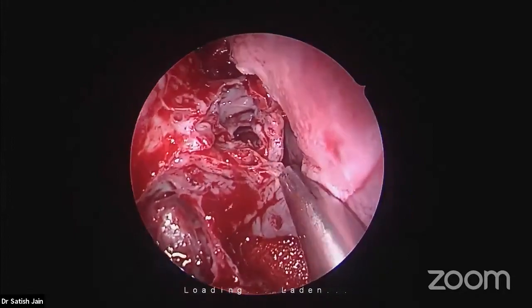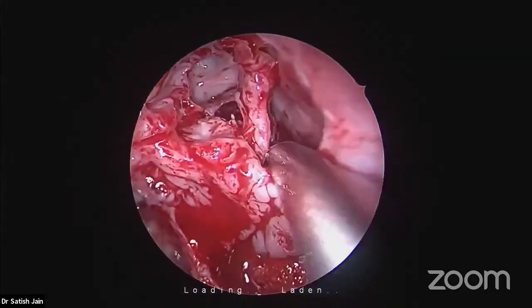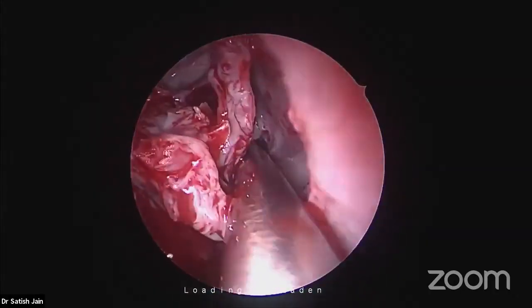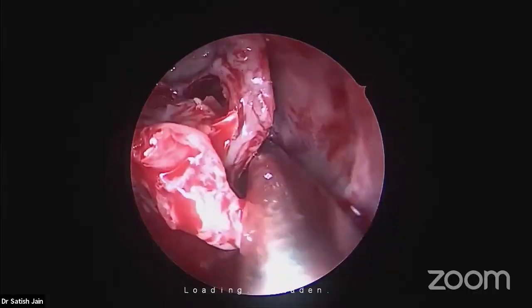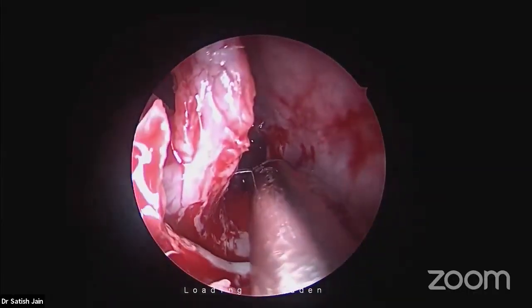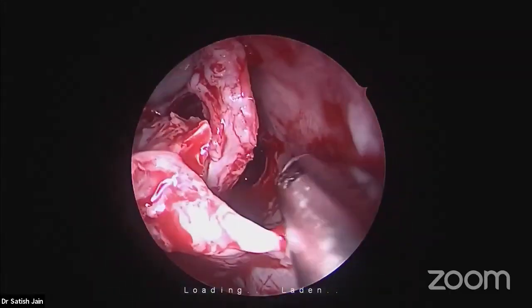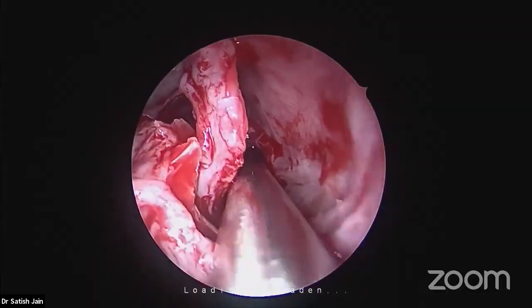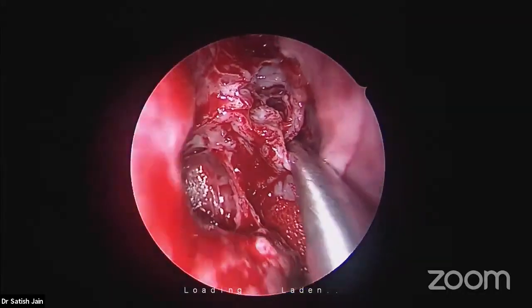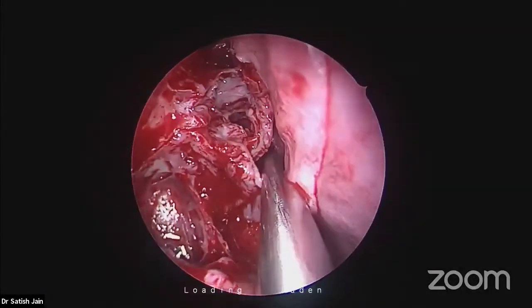So always take this line into consideration. See this line here? Stay close to the septum, not close to the turbinate. Close to the septum, and this is your sphenoid opening. Mind it. Flush to the septum, at the level of what? The maxillary line. Can you see?